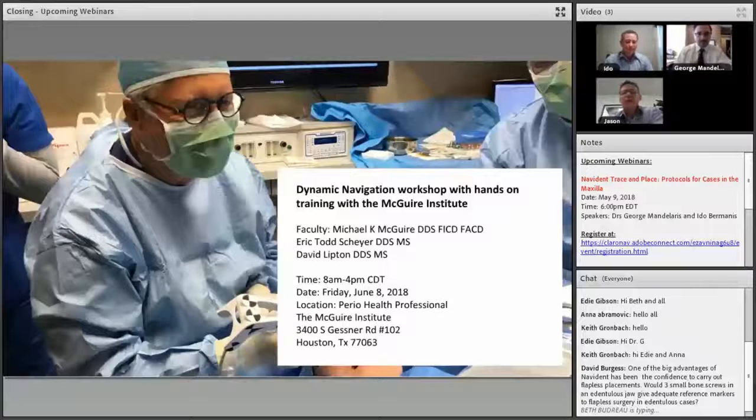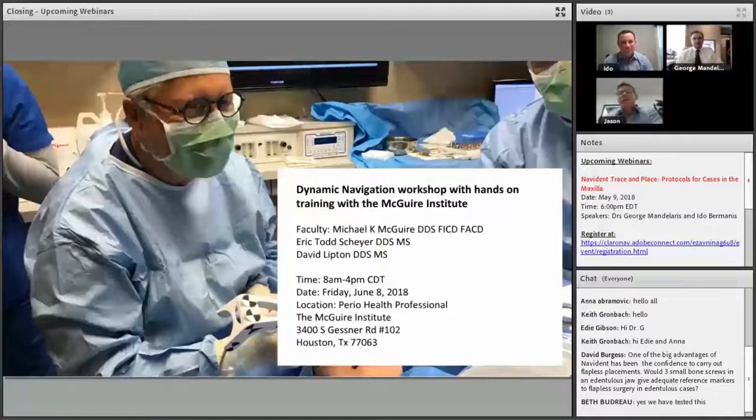Okay, I don't think we have any more questions. Let me check the chat down here. Dr. Burgess is asking a question, and yes, that's exactly what we think. He's asking whether 3 small bone screws in a fully edentulous jaw give adequate reference markers for flapless surgery in edentulous cases. I'm just not a big fan of flapless cases. My experience is that you need a little bit of a flap. Otherwise, you're basically blowing out all the attached gingiva around. Keeping it minimally invasive is key, and that's definitely the future. But be mindful of the attached gingiva in the area so that you don't end up with mucosa all around your fixtures, and you at least have the zone of attached gingiva.